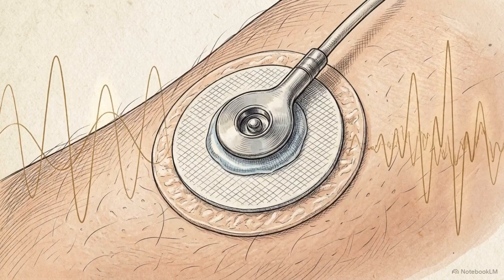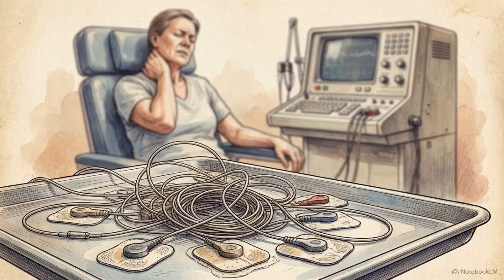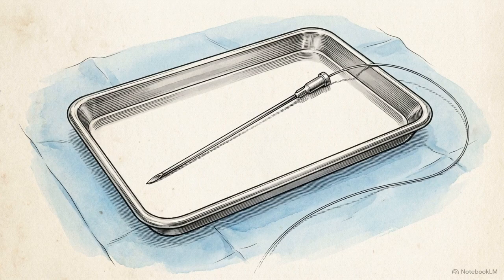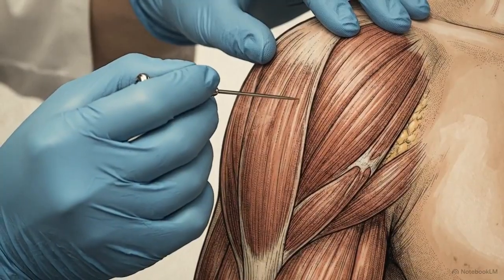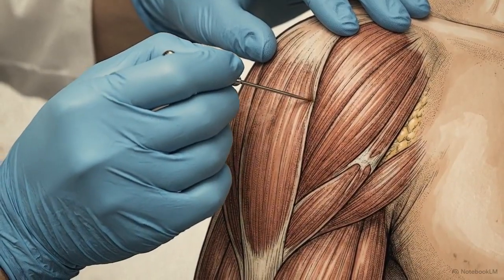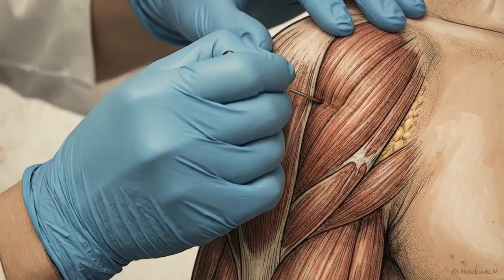Surface stimulation cannot reliably detect fractional motor loss, nor can it detect preganglionic sensory damage. Because of these physical limitations, surface nerve conduction studies are entirely insufficient for ruling out a radiculopathy. Because surface conduction studies lack the necessary sensitivity, diagnosing active motor axon loss requires inserting a needle directly into the muscle tissue during the needle electrode examination.